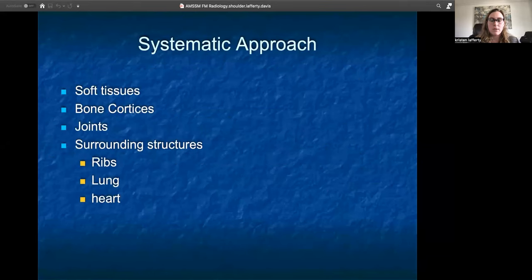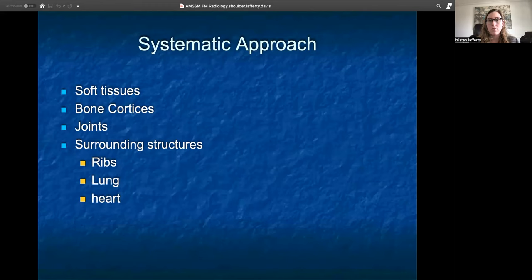Starting with the systematic approach, when obtaining or looking at x-rays of the shoulder, I always start with looking at the soft tissues and then moving on to my bone cortices. So looking at your clavicle, your scapula, acromion, humerus, and all the relationships between those, and then specifically moving on to the joints.